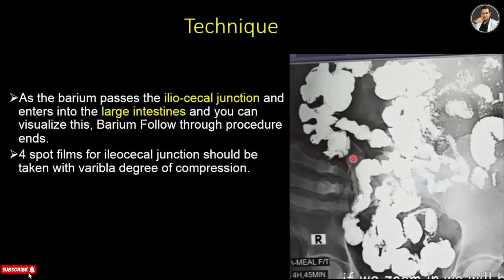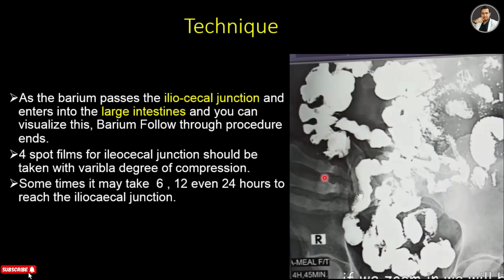And then you have to take 4 spot frames of this ileocecal junction at different degrees of compression. And it may take 6, 12, or 24 hours to reach the ileocecal junction, and it depends on the condition of the patient's peristalsis movement.